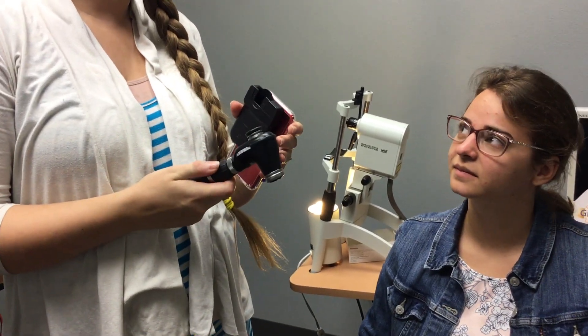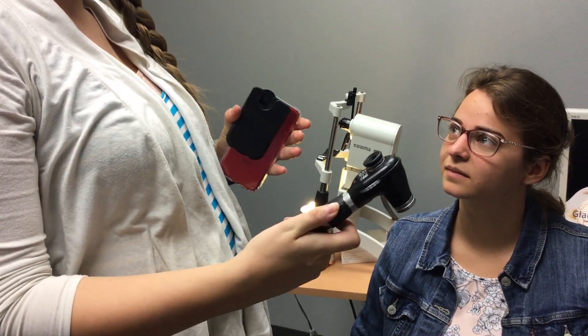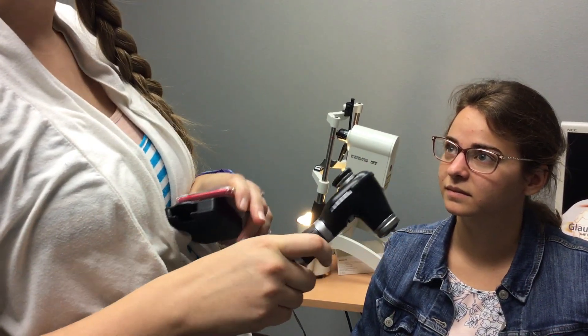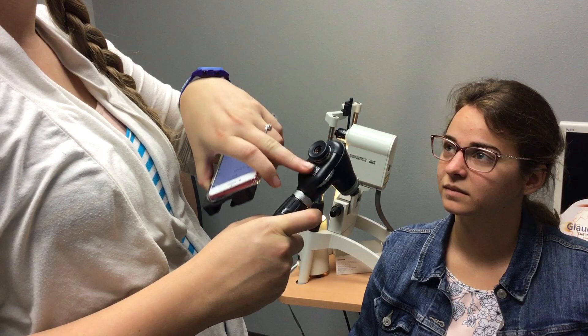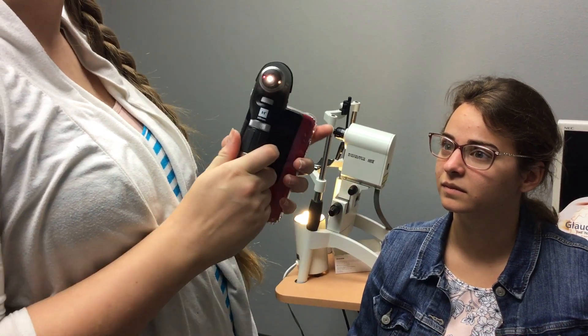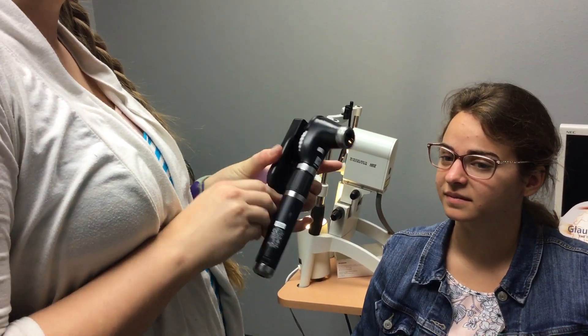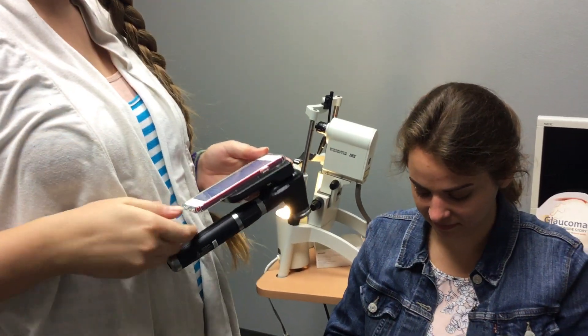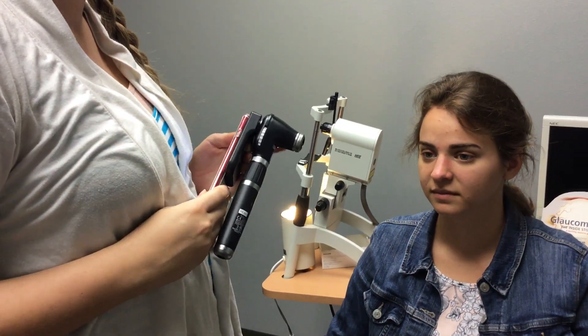I first start by clicking this a couple of times — two or three times — and then I look at their prescription and see if it's minus or plus and put the diopter accordingly. If you take your glasses off for me — I usually do it with a more dim light, but for the video we have to do a little bit brighter.